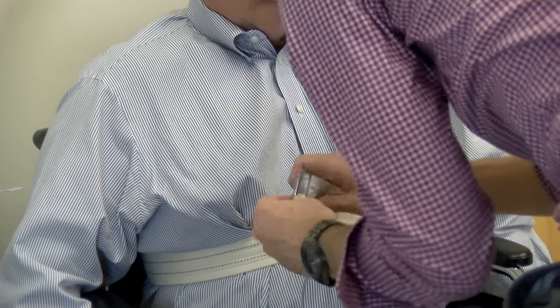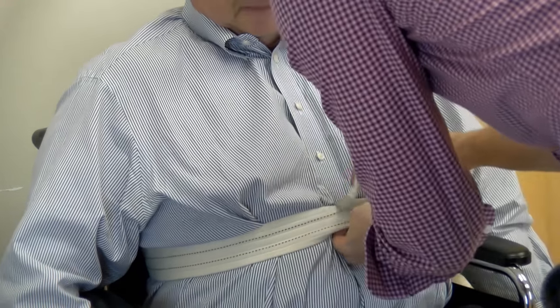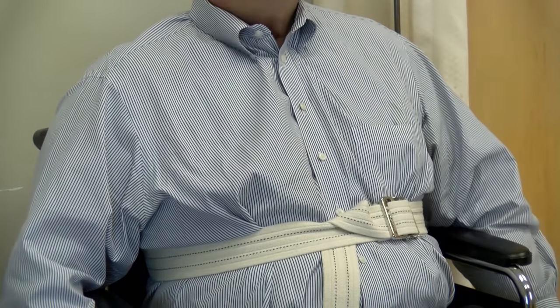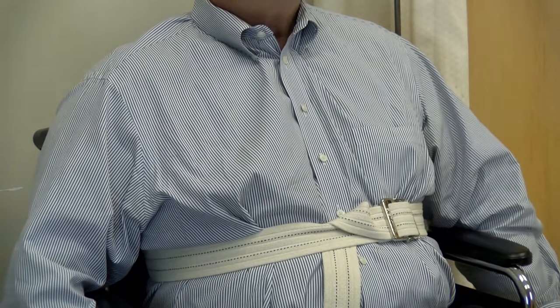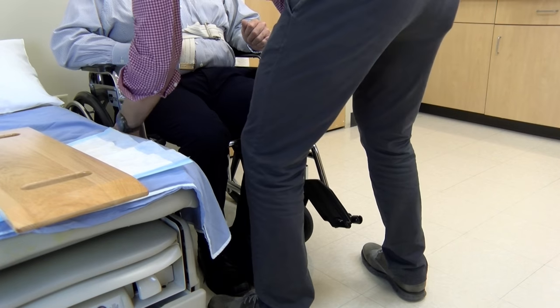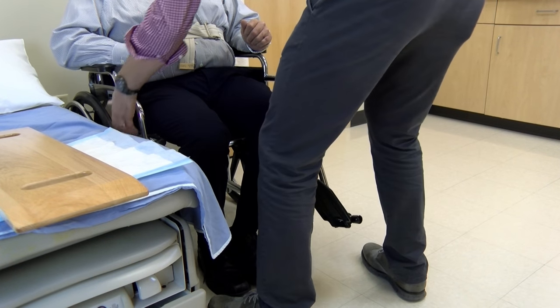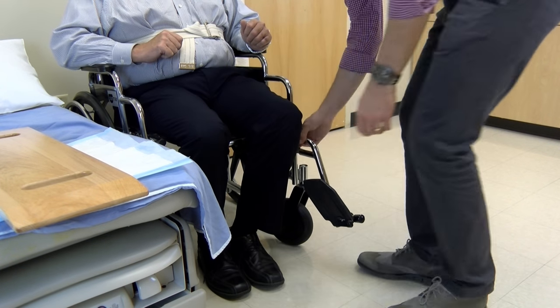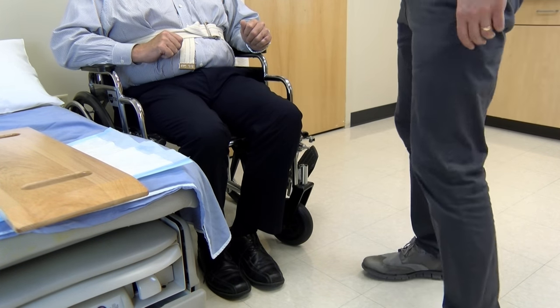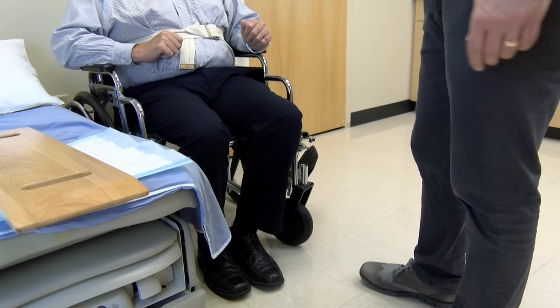Be careful to watch or ask the patient about any recent abdominal surgeries or colostomy bags. In those cases, you may have to place the belt higher or lower to avoid incisions or devices. Make sure the brakes of the wheelchair are locked and the leg rests have been swung out of the way or removed to avoid any possible skin tears or tripping hazards.